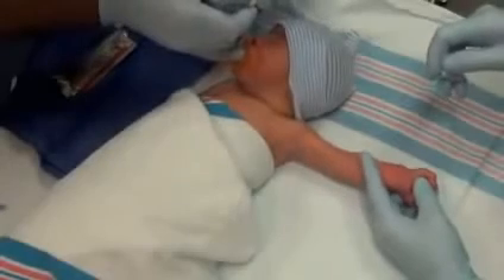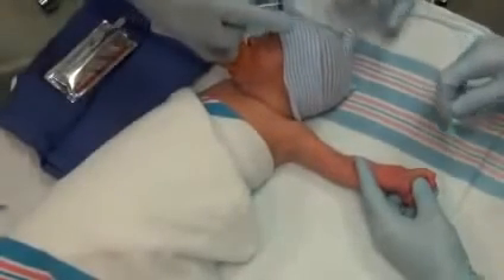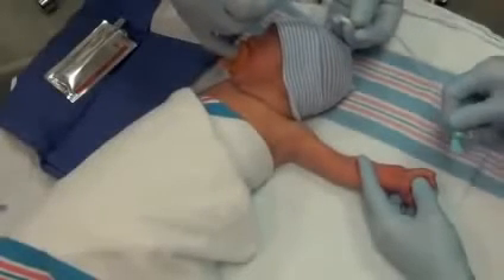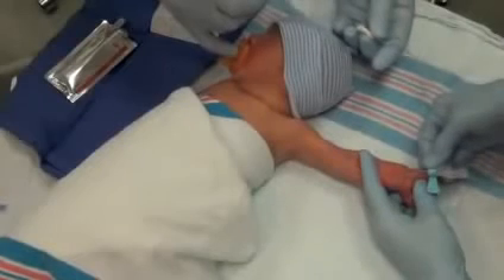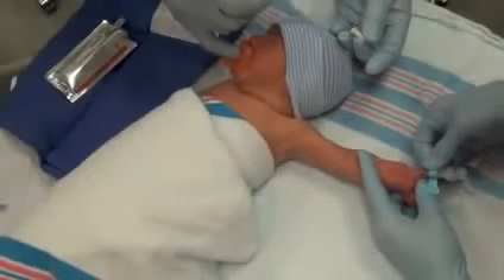Puncture the skin and penetrate the artery at a 15 to 25 degree angle with the bevel down. Or, puncture the skin and penetrate the artery at a 30 to 45 degree angle with the bevel up. The shallow approach is recommended in the preterm infant.